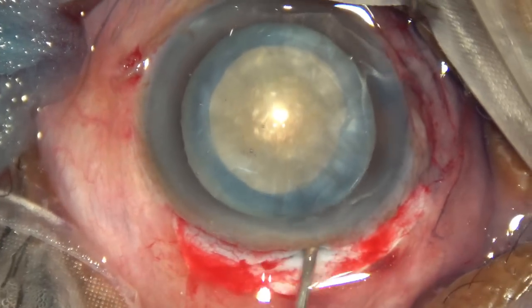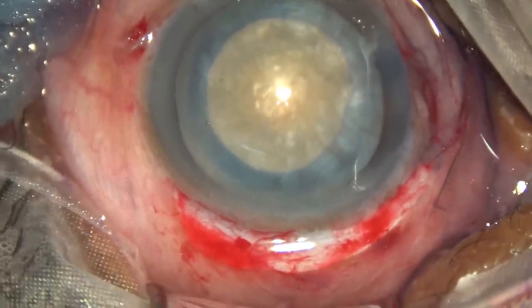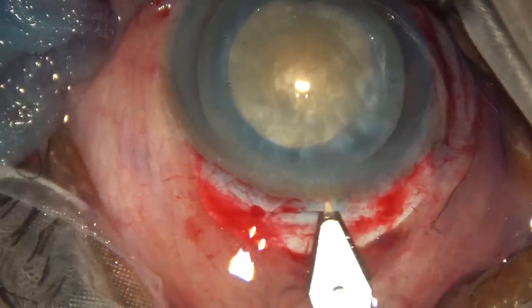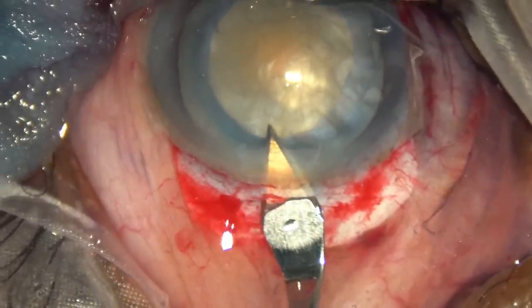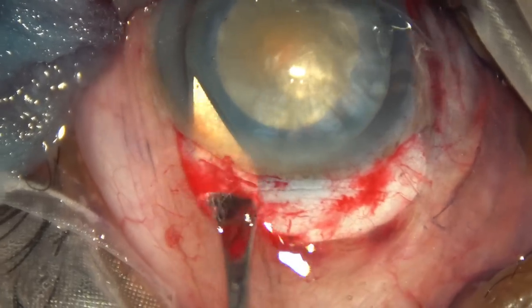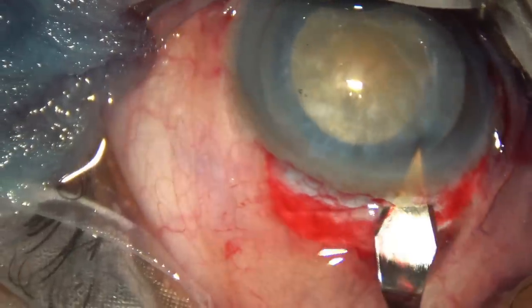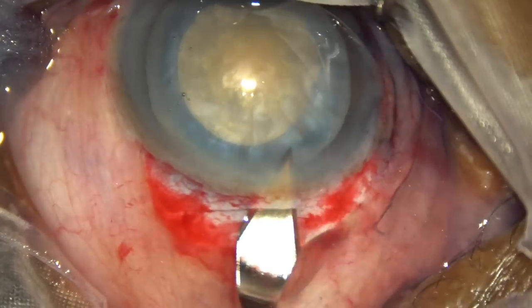Now we are going to open the tunnel. Again, we have to go in the anterior chamber and now go to the left side and cut with forward movements. Engage at the side and cut with forward movement. Engage on the right side and cut with forward movements.